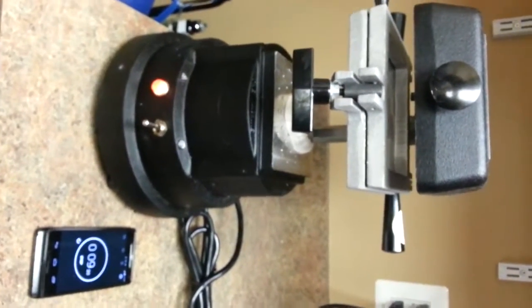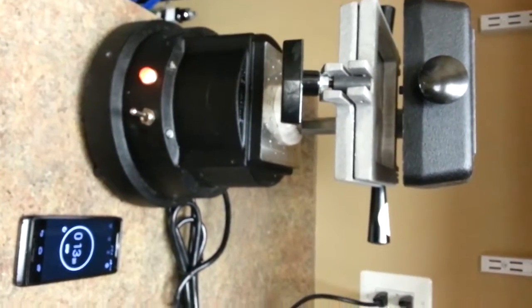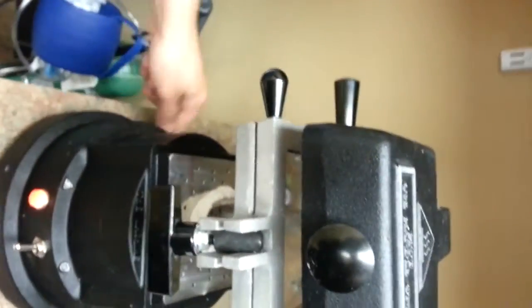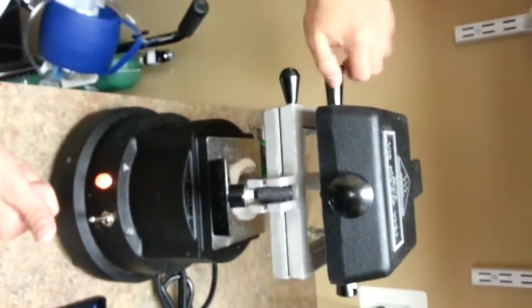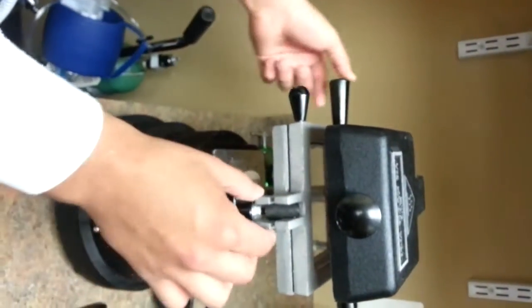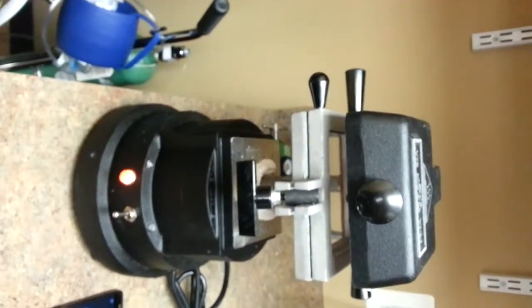Now, our next step, once the 2 minutes are up, is to untighten this side, bring it down, and turn the vacuum on. Again, we untighten this up, we bring the whole system down with the plastic, and we're going to turn this on, which is the vacuum.